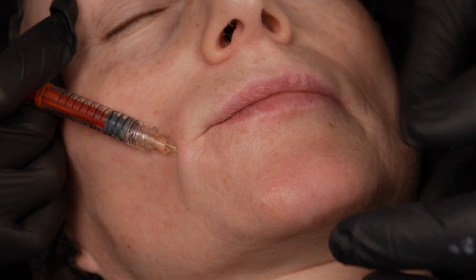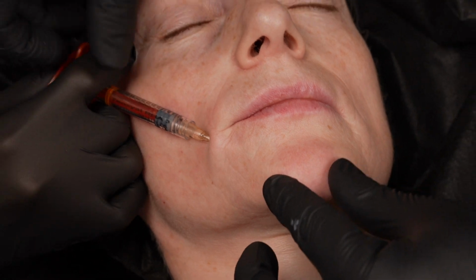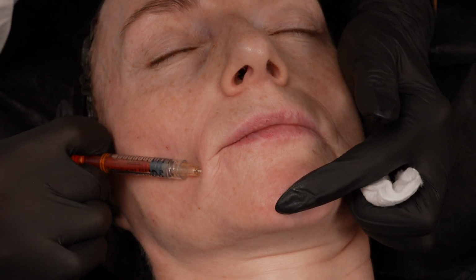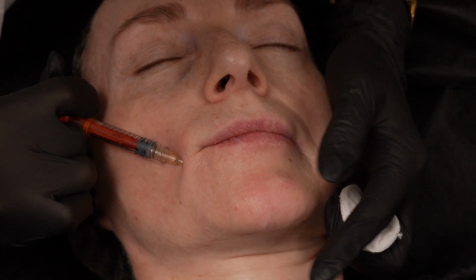Поэтому отрабатываем технику, потом переходим. Тройка будет хорошо там. Finished.